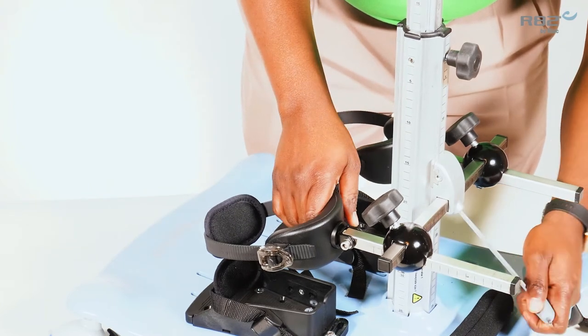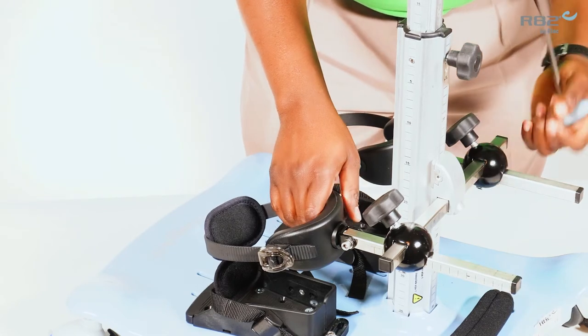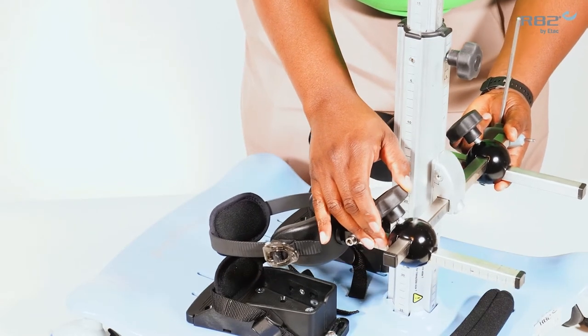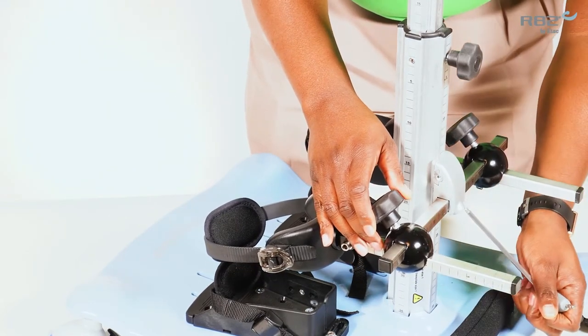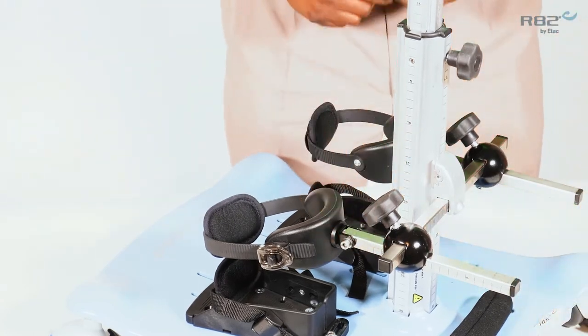To perform this task, loosen the 5 mm bolt located in the rear bottom of your mounting bracket. This will allow bilateral adjustment of your knee support. Once you reach your desired width, tighten the mount back.